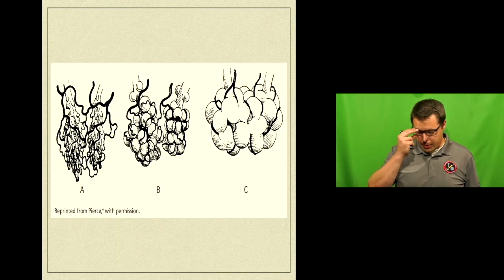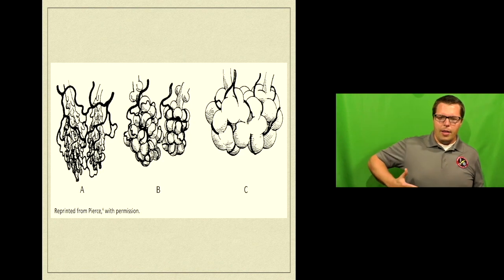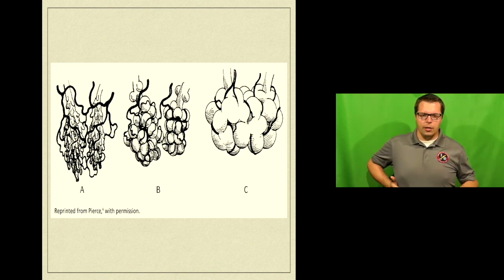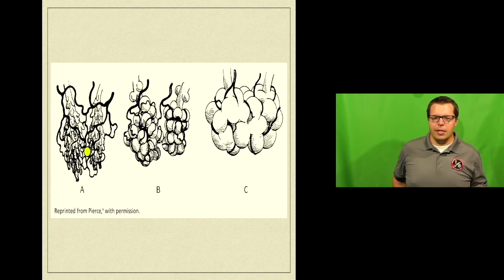What am I talking about? Well, if you look at your lungs, you find basically three different configurations that the alveoli are in. The alveoli in the bottom of your chest, in the lower lung segments, are generally speaking going to be squished and collapsed, and they don't get a lot of airflow, and your body knows this, and so they shunt blood flow to other places.